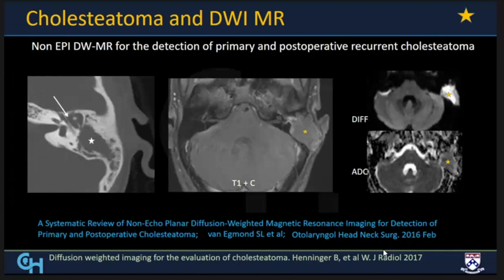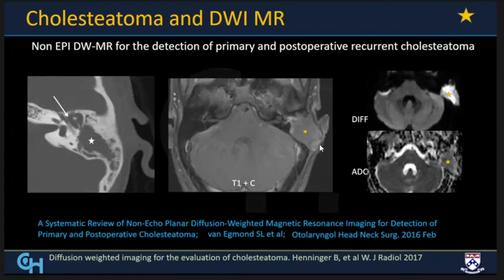Diffusion-weighted MR imaging has been increasingly utilized for detection of cholesteatomas because they demonstrate restricted diffusion. This is a very important distinguishing feature from granulation tissue, which does not restrict and typically shows enhancement. Cholesteatomas do not show enhancement and may co-exist with a small amount of surrounding granulation tissue. They will be bright on diffusion and show low signal on the ADC maps.